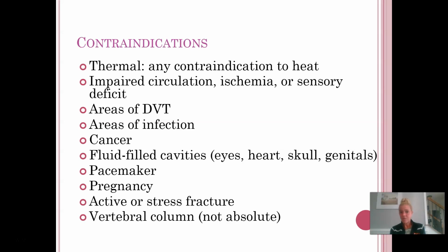So same thing goes for cancer. Not sure why we would, but we don't ever want to ultrasound over fluid-filled cavities like the eyes, the heart, the skull, the genitals. Pacemakers are going to be a contraindication. You're going to find that they make a lot of the contraindication lists, as does pregnancy. And I get asked this a lot: will pregnant women go for ultrasounds? Why would we not want to ultrasound them? Again, this is repeated exposure. We're not exactly sure what it's going to do, and we don't want to take any chances with it potentially doing any harm.